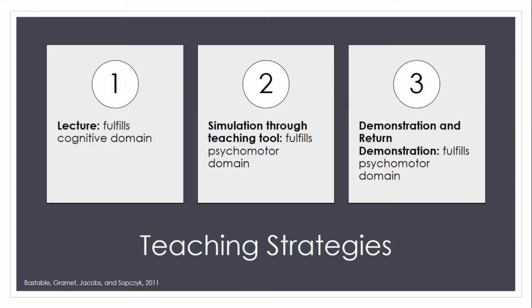To fulfill both the cognitive and psychomotor domains, the teaching strategy was developed to consist of multiple stages. First, the technologist will receive the foundation of education through a lecture presentation. Next, the technologist will be provided with a simulation through the teaching tool that we'll be discussing in a little bit. And lastly, the technologist will observe a demonstration and produce a return demonstration with me, the educator, during their first neonatal brain ultrasound.